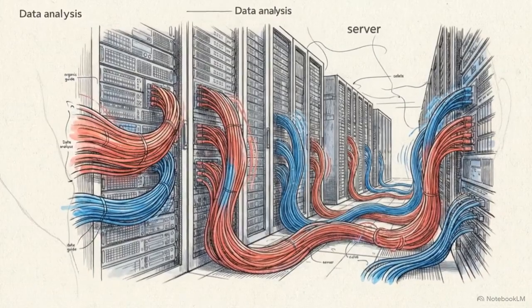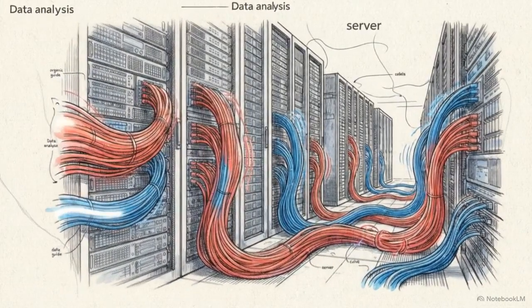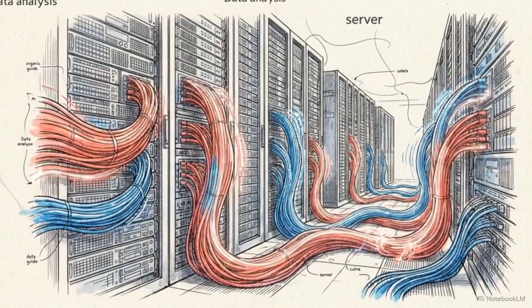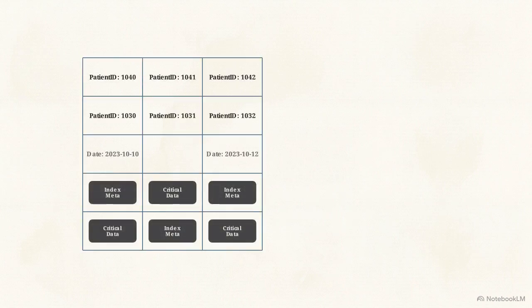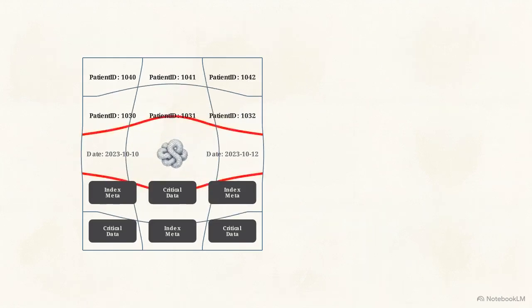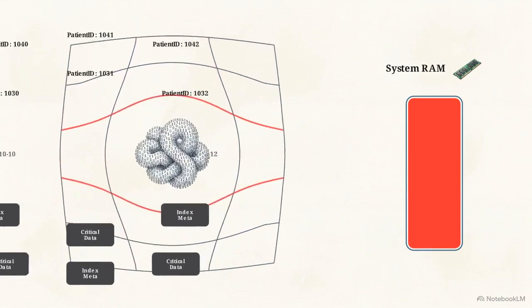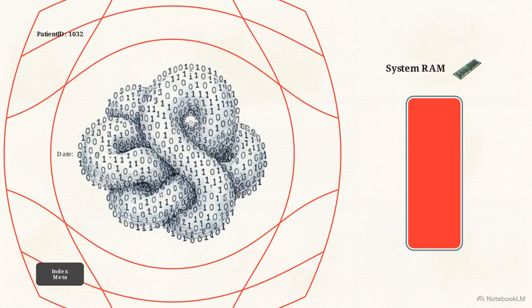Before a database can analyze an image, it must solve the physical bottleneck of holding massive files without compromising system stability. Legacy systems forced raw binary streams directly into SQL table cells as binary large objects, or blobs. Storing gigabyte files in relational tables causes severe delays in database backups. It also compromises memory caching, pulling massive payloads into RAM and crowding out critical data.